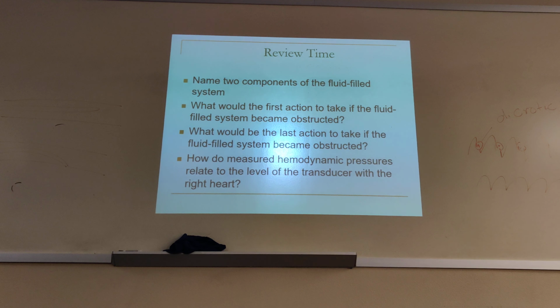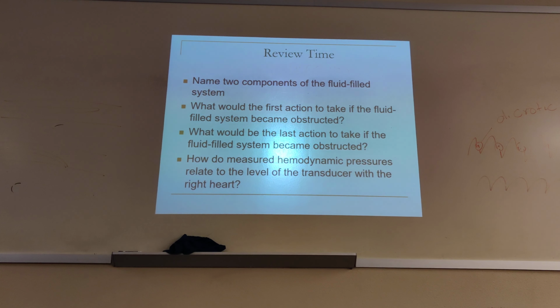Then, two components of the fluid-filled system. Anybody? The flush system, yeah, the flush system. And then what else? Yeah, the catheter.